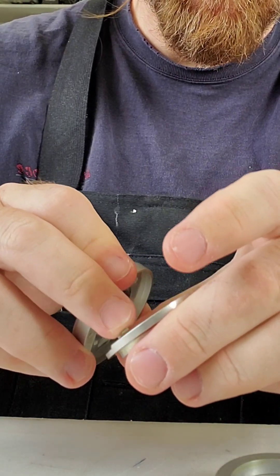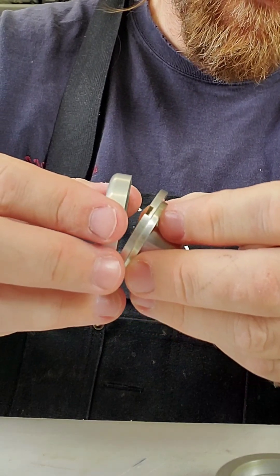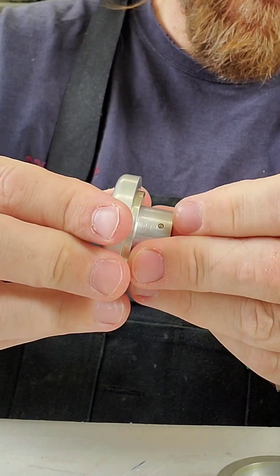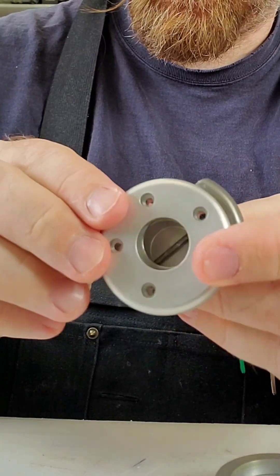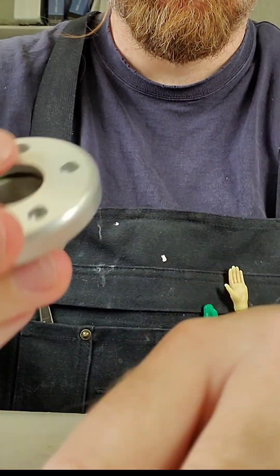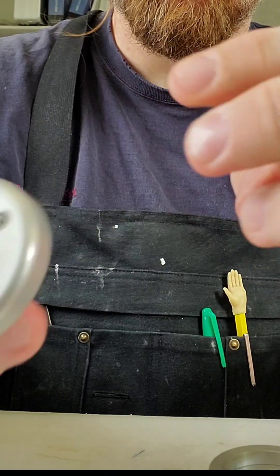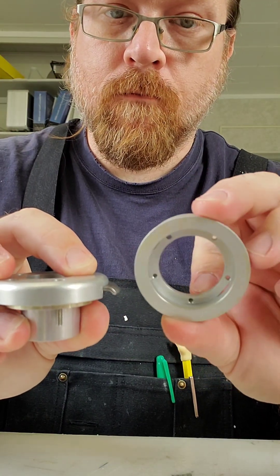There it is with the spring in place. It has two more little springs holding the plate up against the bottom of the face there. So when that's all in, the five screws will go through and that'll lock it into the lamination base. Once it's back together, the little screws will go back in, and this part will be laminated into the actual unit.